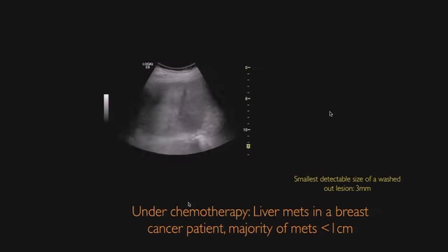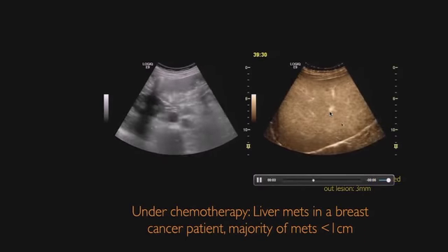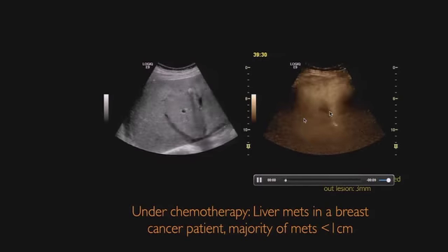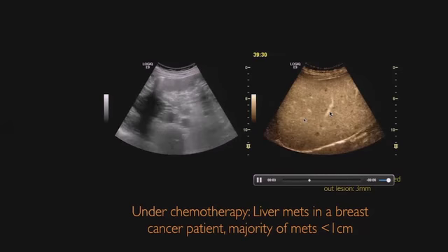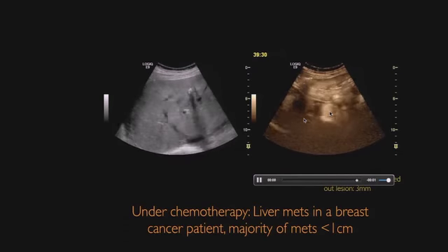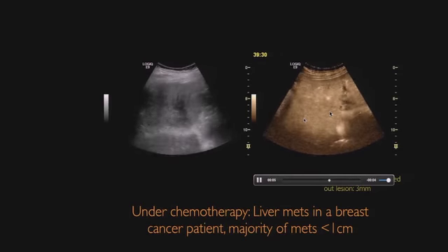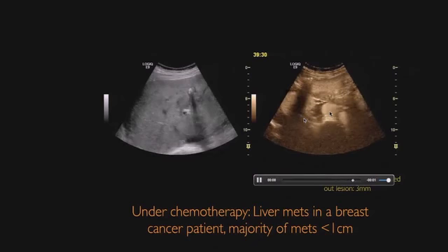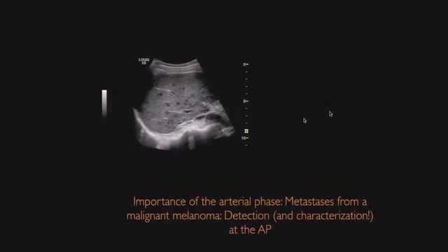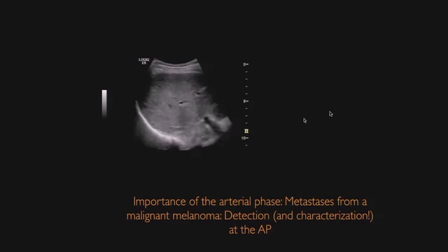And so this is what you can see now, a big metastasis, and all the tiny lesions here that have been washed out are metastases. So we counted, and the number was over 50 metastases. Most of them range between 3 millimeter and 6 millimeter. This is something that we can see very nicely. CT was performed on that patient, and CT saw only a handful of metastases. So I think we are much more sensitive in most cases, if we have good scanning conditions, of course, that is a must, so that you can really see the liver quite nicely.